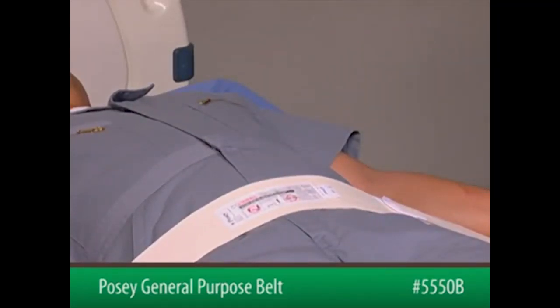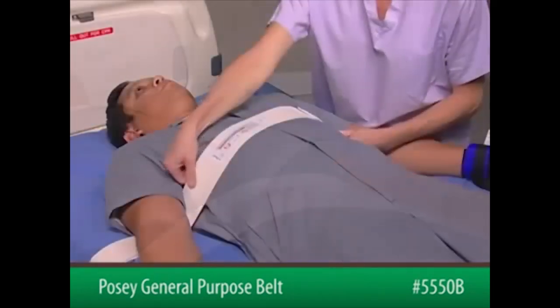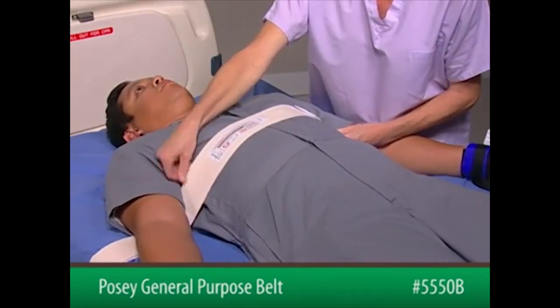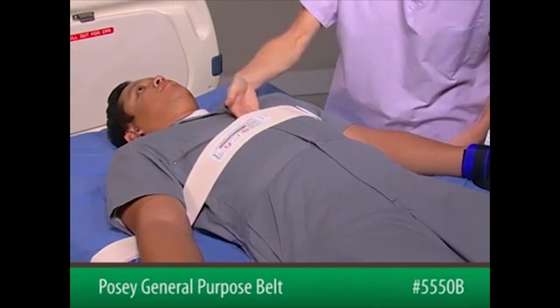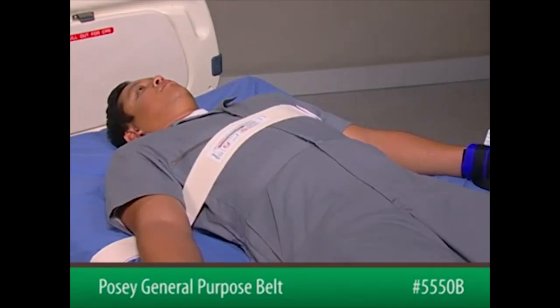A second or third belt at the waist, thighs, or knees may be needed to hold an aggressive patient in the supine position. When using over the chest, the strap should go under the arms and attach at chest level to a movable part of the bed frame. This will prevent the patient from sliding down and becoming entangled.